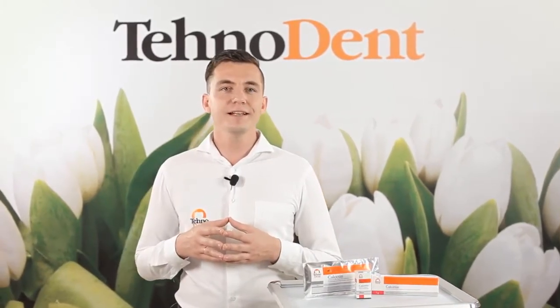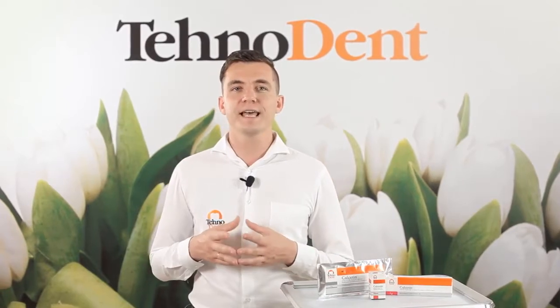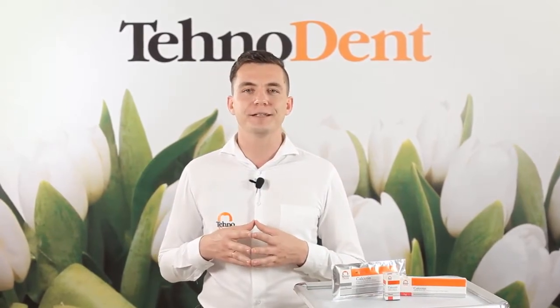For the treatment of chronic periodontitis, after a diagnostic study of the morphological characteristics of the roots of teeth and periapical tissues with the help of X-rays, mechanical and pharmacological treatment of the root canal should be carried out. The root canal is prepared to put the paste Calcetin for endodontic treatment.